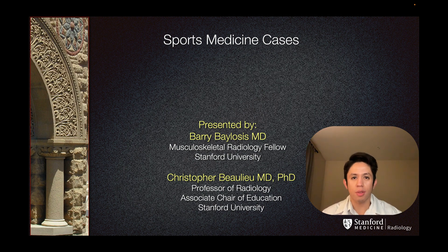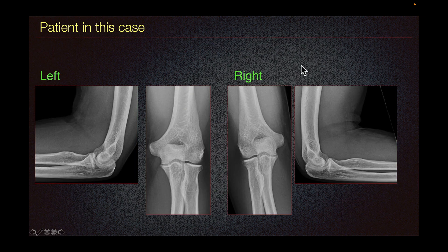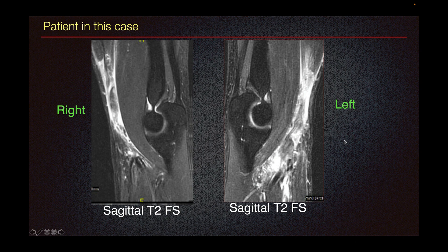This is Barry Baylosis, one of the musculoskeletal radiology fellows at Stanford University. The patient in this case presented with bilateral AP and lateral elbow radiographs, which are normal. This is often the case in the setting of biceps tendon tear. In some cases we can see some edema, but in this specific case we have a normal radiograph. The patient then underwent MRI.